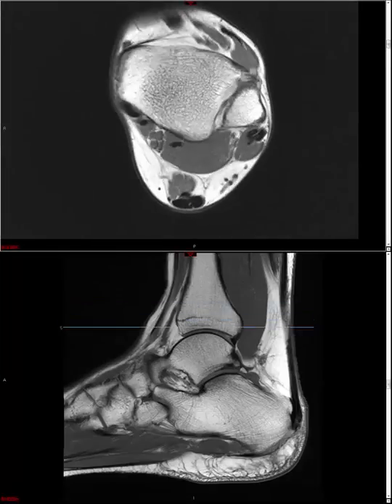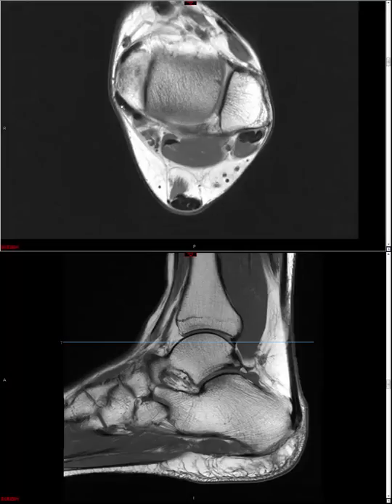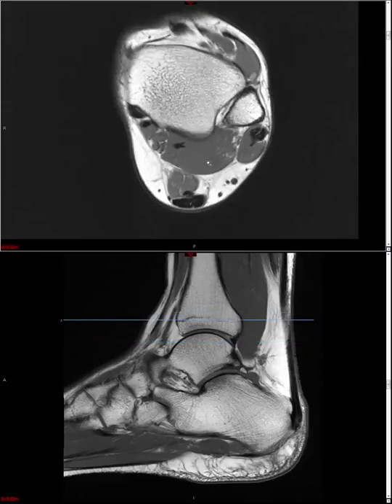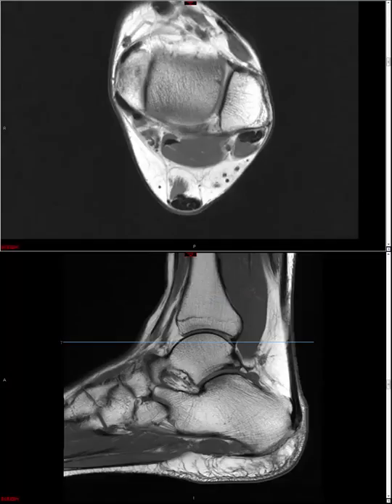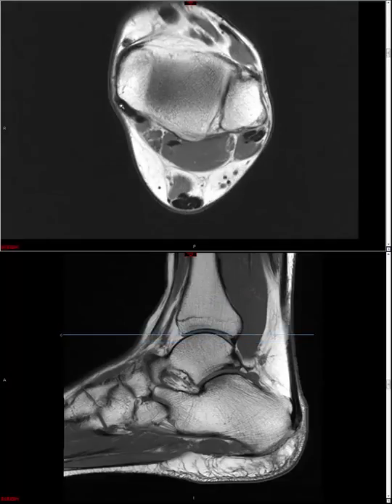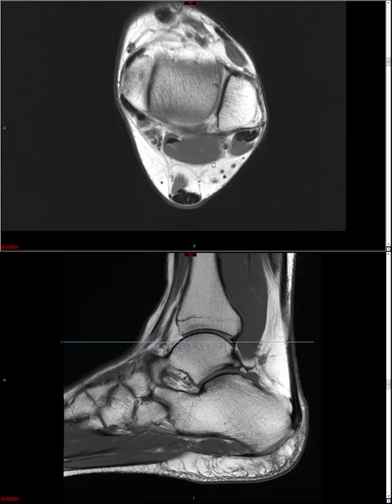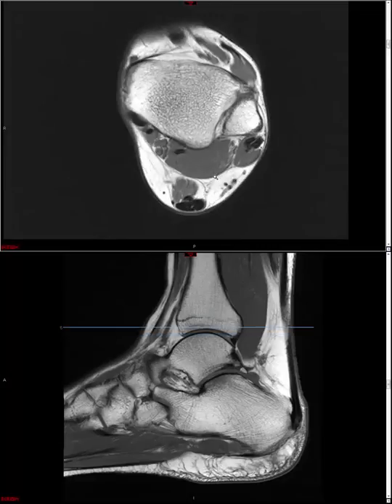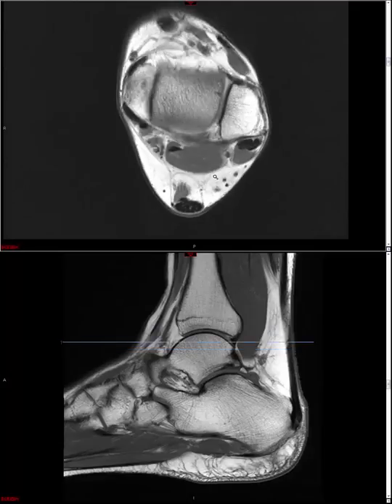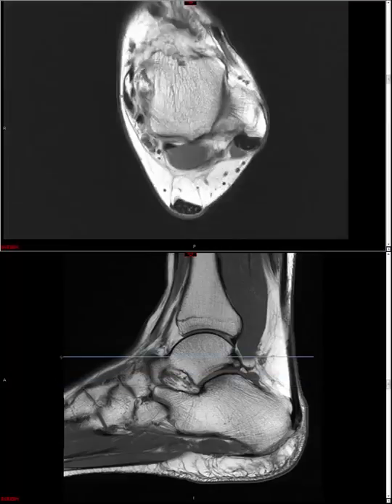Let's now look at the deep posterior tendons, which include the tibialis posterior, flexor digitorum longus, and flexor hallucis longus tendons. To remember the order, we use the mnemonic Tom, Dick, and Harry — and we can extend it to Tom, Dick, and Very Nervous Harry, where 'and very nervous' corresponds to the tibial neurovascular bundle. We use the axial sequence to look at these tendons; like other tendons, they should be homogenous low signal. It's important to become comfortable with the relative sizes: tibialis posterior should be twice as big as flexor digitorum longus.